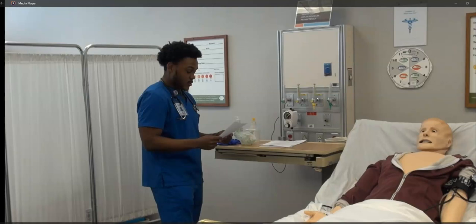Hello and welcome. This is a demonstration of Skills 3, Administering Oxygen via Nasal Cannula without humidification. You have 6 minutes to demonstrate this skill. Let's begin with steps 1 through 5.